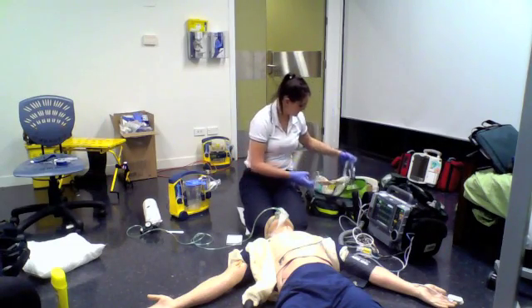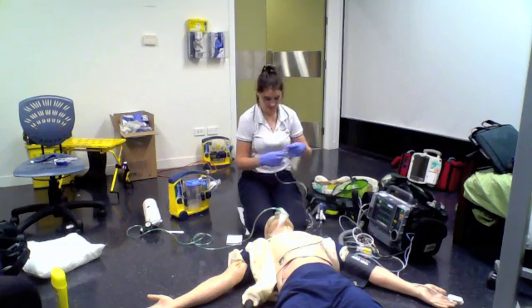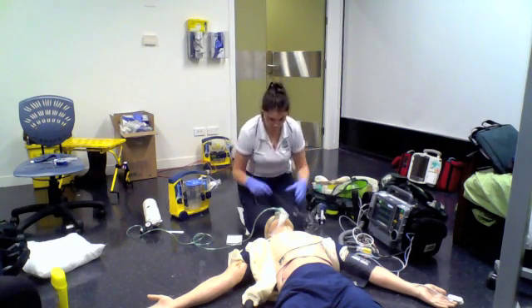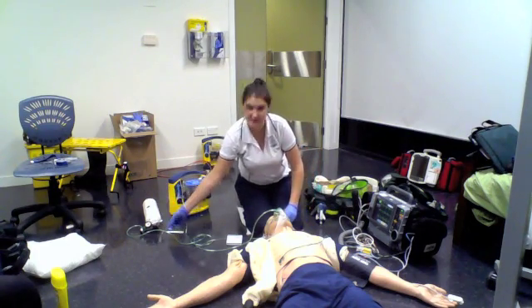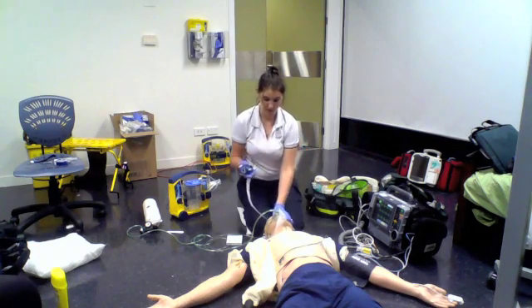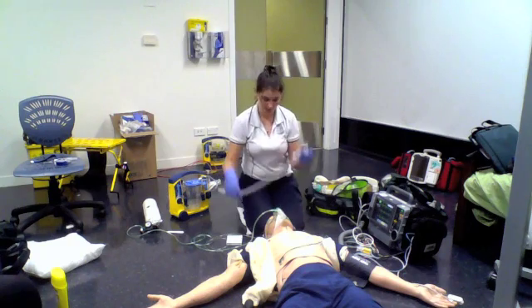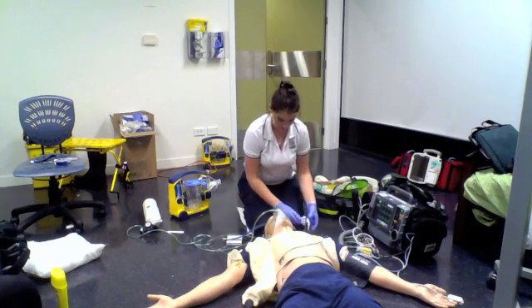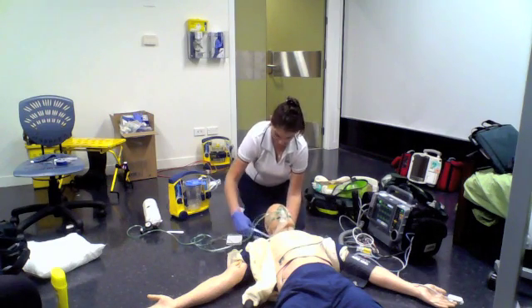To prepare for RSI, I'm going to put some nasal prongs on the patient. My nasal prongs are set up and they're ready to go for supplementary oxygen when the RSI takes place. Right now we're pre-oxygenating the patient with the reservoir mask. We're putting a Thomas tube holder under the head for the ET tube. So we're preparing that.